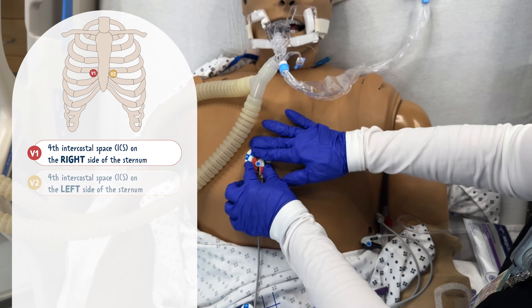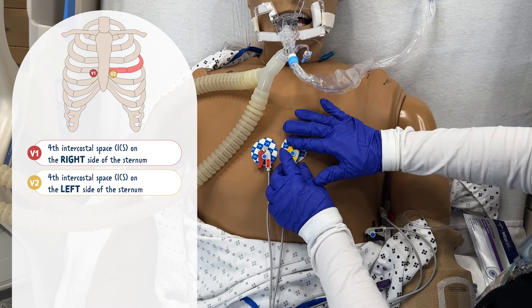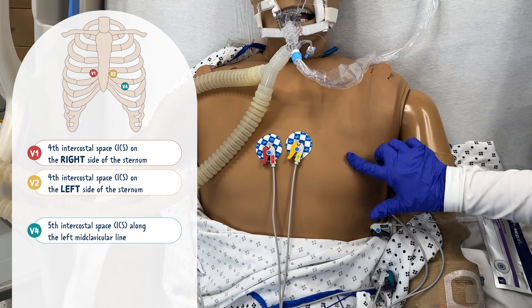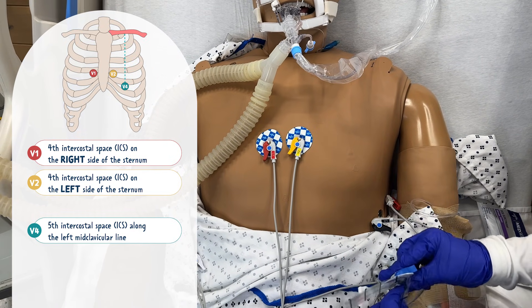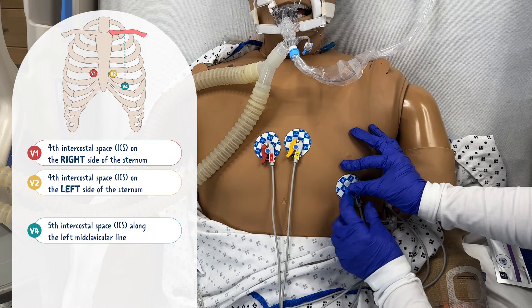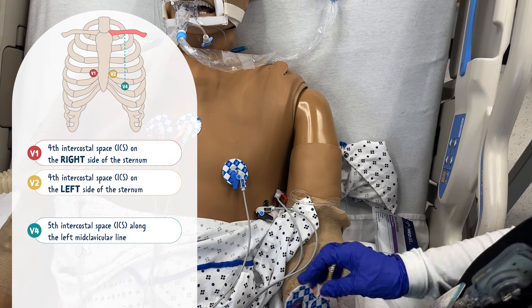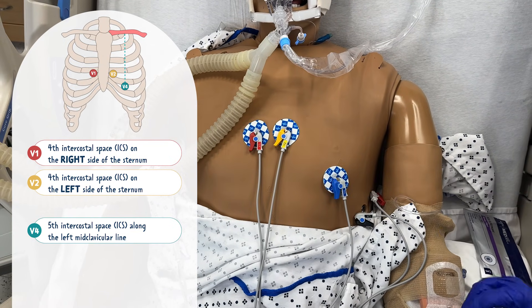Let's start with V1 and V2. These go on the right and left side of the sternum at the fourth intercostal space. Now skipping to V4 — the V4 electrode is placed at the fifth intercostal space along the left midclavicular line. Think of where the clavicle is; it's the middle of that, so basically the middle of the patient's left chest. A pro tip: if your patient has a lot of breast tissue, the V3, V4, and V5 leads will likely be placed under the breast.